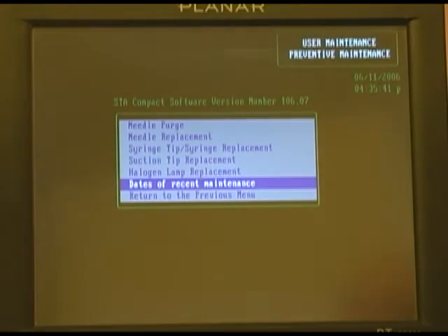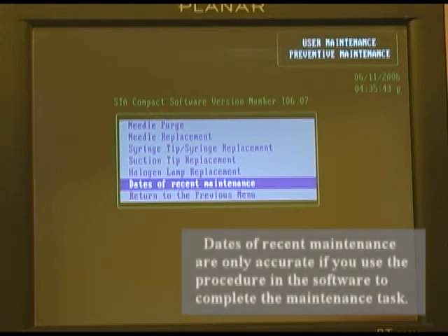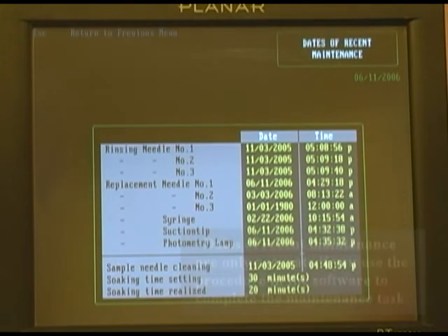You can also review when the maintenance was performed on this system. When you follow your hospital standard protocol and the manufacturer's recommendation, every time you complete those maintenance tasks, it is written to the log file, and you can review the log file by going here and seeing the dates and times these tasks were last completed.